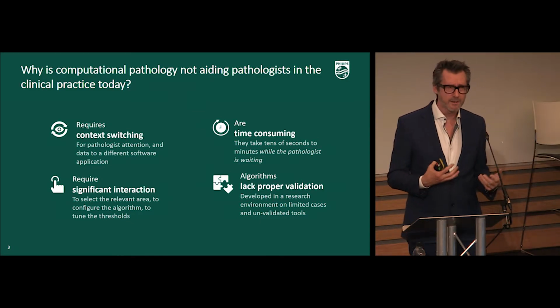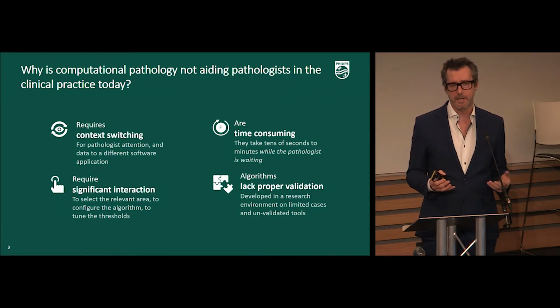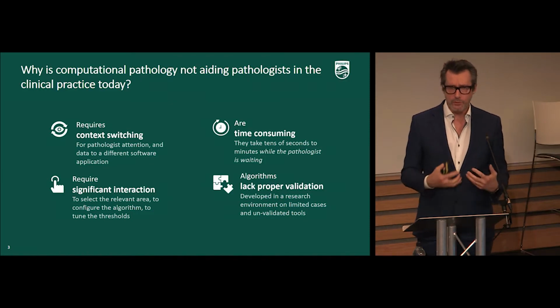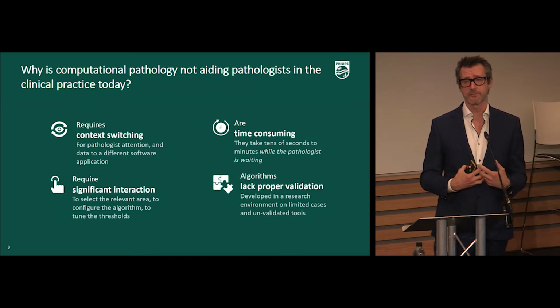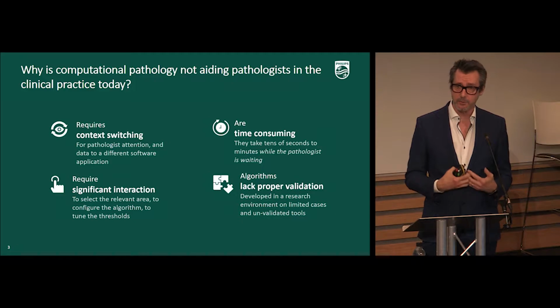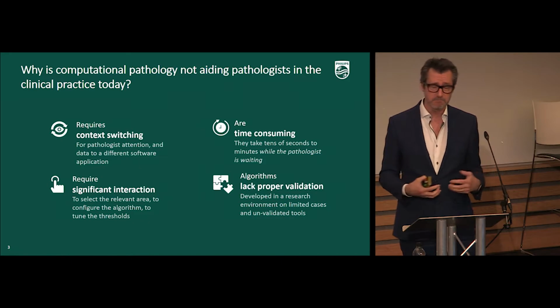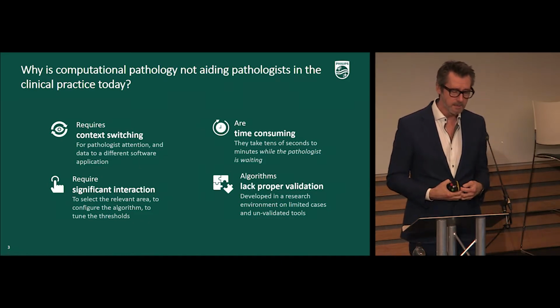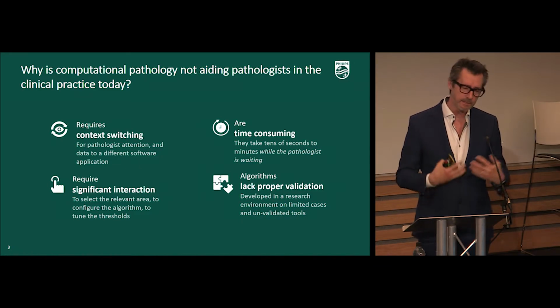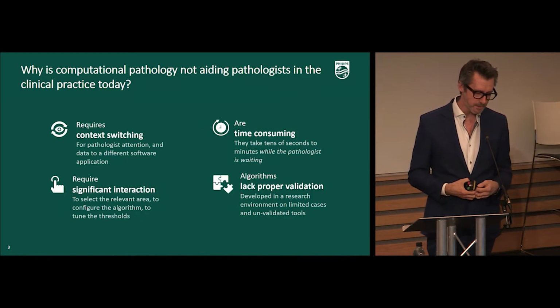Many of the algorithms require significant interaction, so the pathologist needs to go in and set thresholds for certain samples to be able to define what the algorithm is measuring. And again, for routine diagnostic practice where pathologists are facing significant daily workloads, that effort is often just too troublesome to adopt. Algorithms tend to be quite time-consuming, and not in all settings, but in many settings, where the pathologist has to annotate areas and then sit and wait for the algorithms to run and generate the data. And of course, again, in a very busy routine diagnostic laboratory, that poses challenges.